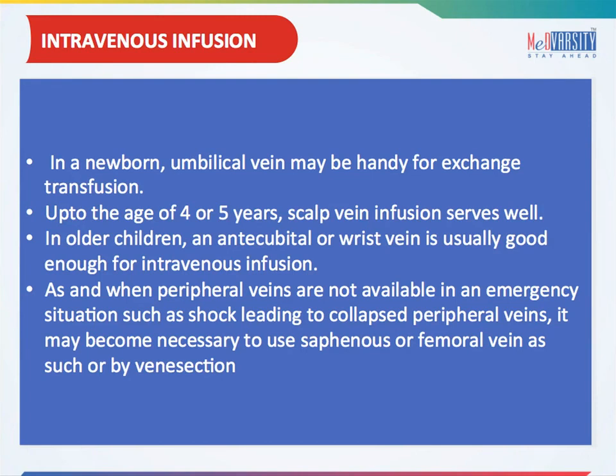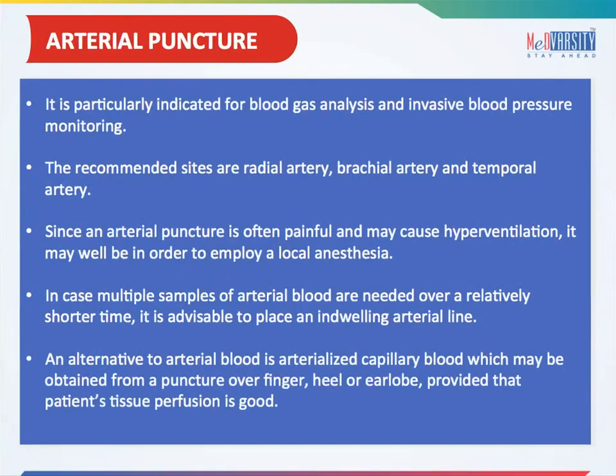As and when peripheral veins are not available in an emergency situation, such as shock, leading to collapsed peripheral veins, it may become necessary to use saphenous or femoral vein as such or by venesection.